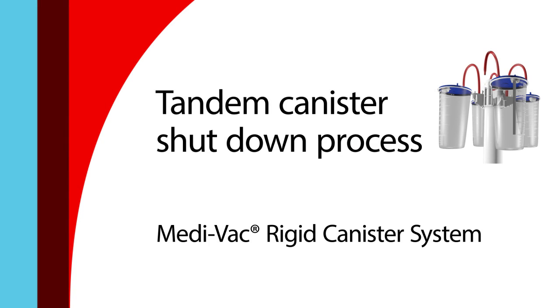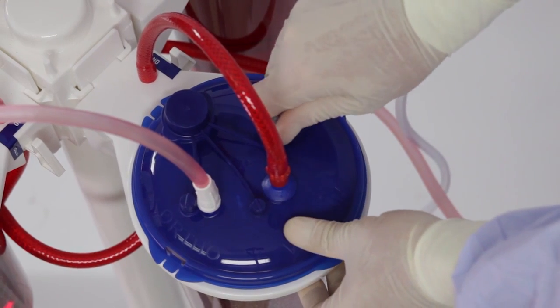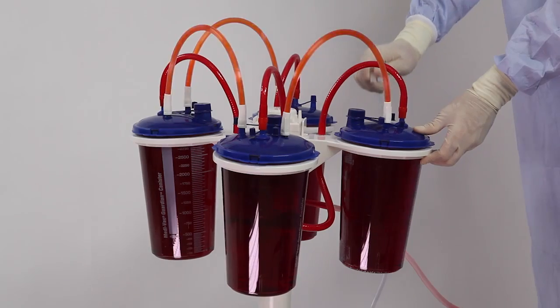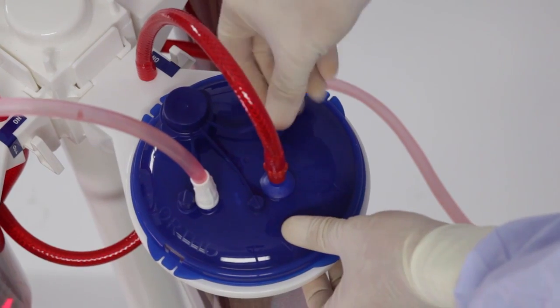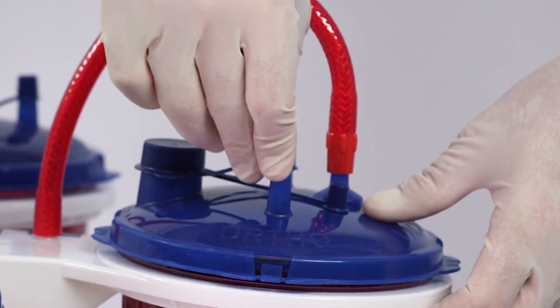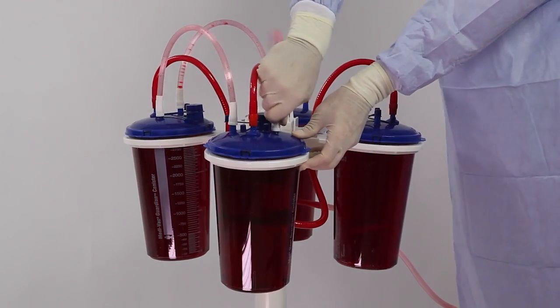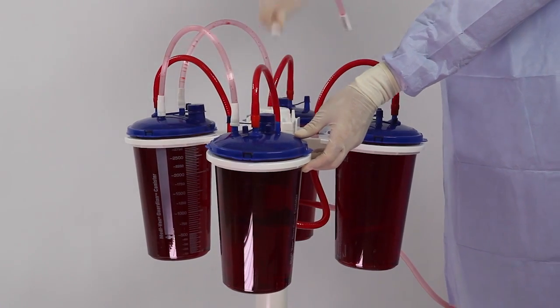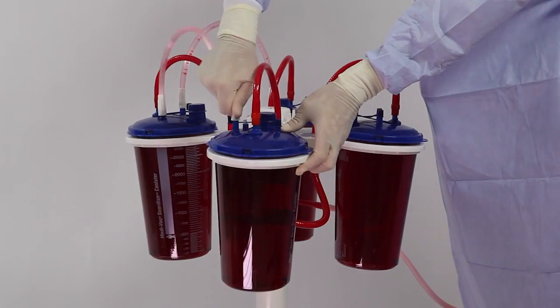While completing the tandem canister shutdown process, ensure the vacuum suction remains on for all canisters until all ports are capped. On the first canister, disconnect the patient tubing from the patient port and securely cap the port. Disconnect the tandem tube and securely cap the ortho port. On the second canister, disconnect the tandem tube from the patient port and securely cap the port. Repeat these steps for all remaining canisters.